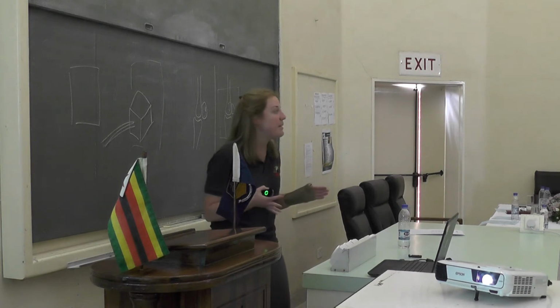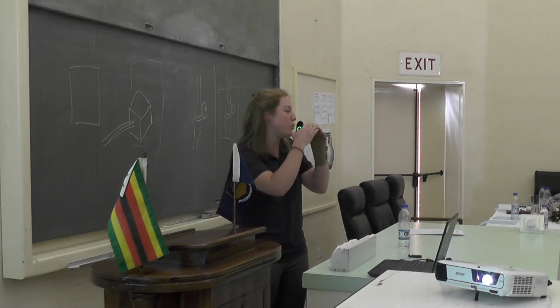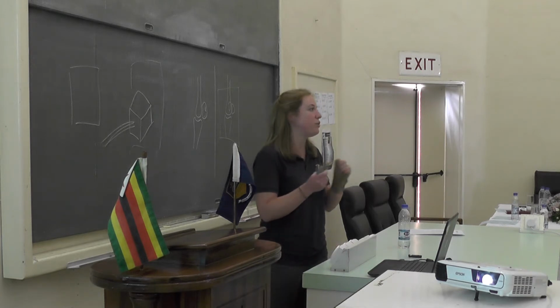So, to get a true lateral, normally you would have to go just a touch behind the patient, just because that's where it's going to open the joint space the best, really. But this comes with experience, it comes with doing lots of them, and it comes with looking at the screen and saying, oh, I'm not actually cutting the joint perfectly well through here, so I need to change my position just a touch to the left or just a touch to the right. That learning comes with experience, so don't worry too much about it.